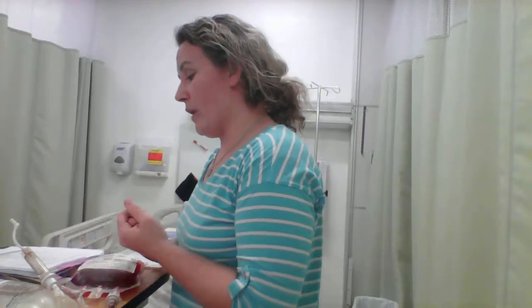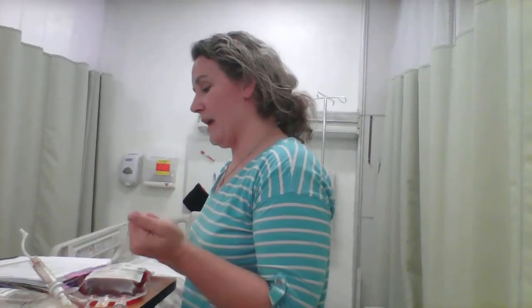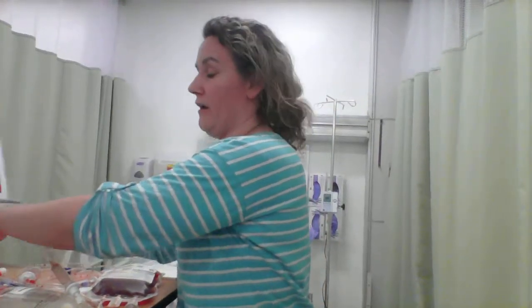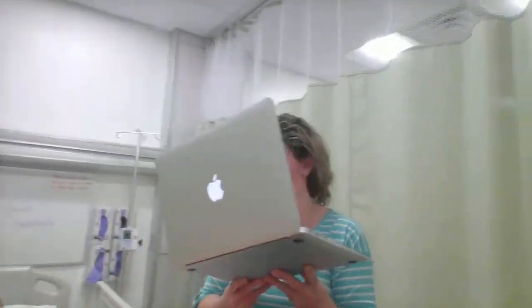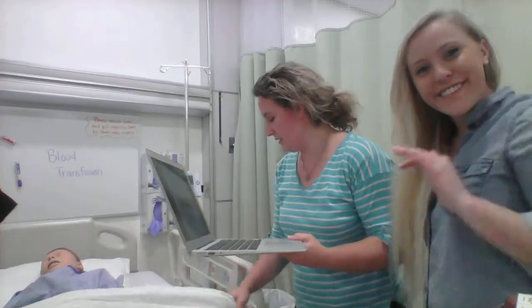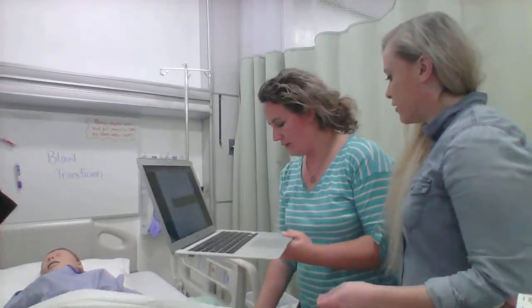So now we're to the point where the nurse is going to come in and verify everything for me. Why don't you go ahead and put that right here, and face it this way. Okay, so here is awesome Jessica, and she is going to look at this wristband for me.